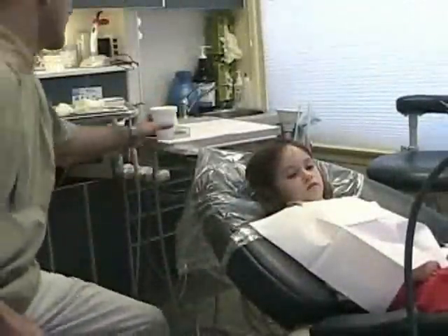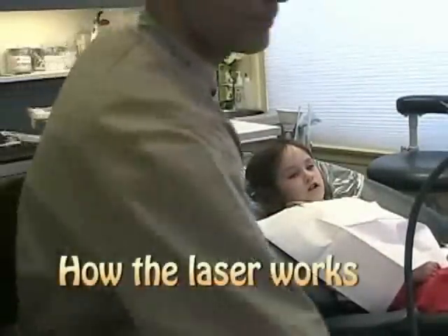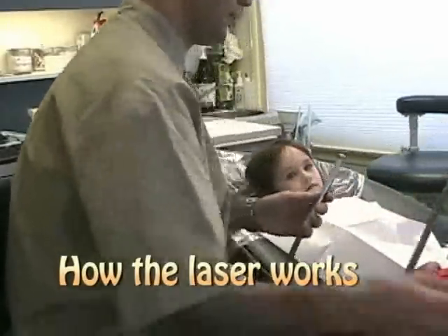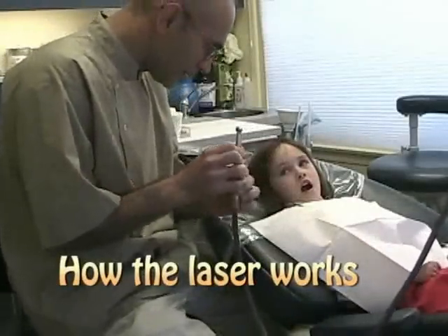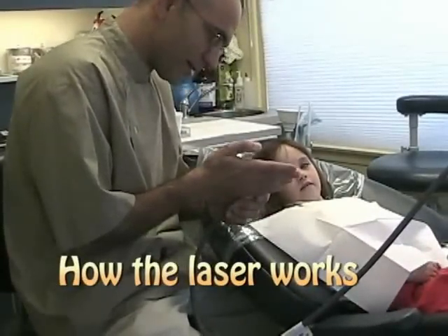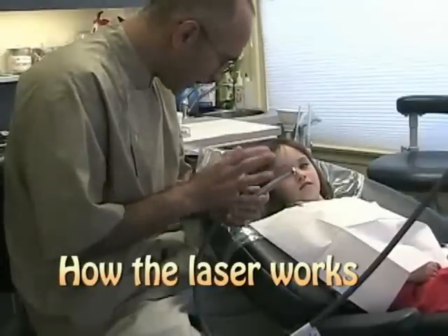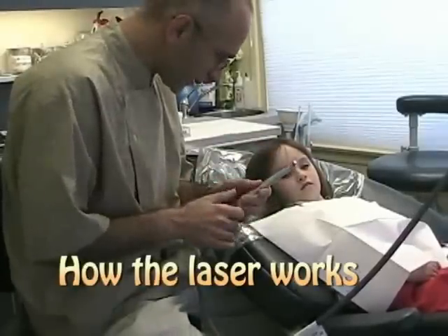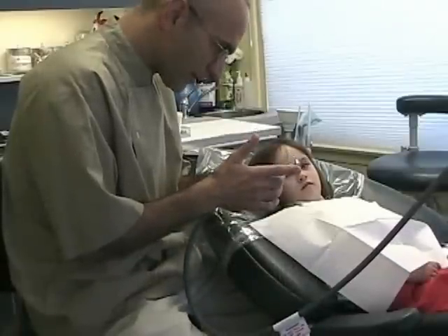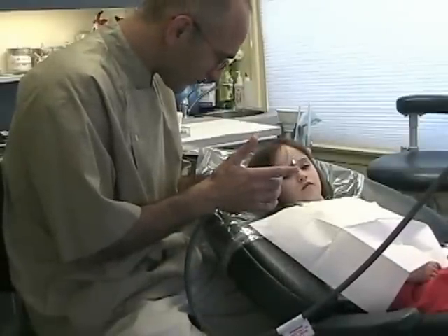I'm going to show you how the laser works. The laser is a little crystal here. It has a little light, and the light starts popping and there's going to be a lot of water coming out. And then we're going to hold it over the tooth and it's going to clean out all the bugs.